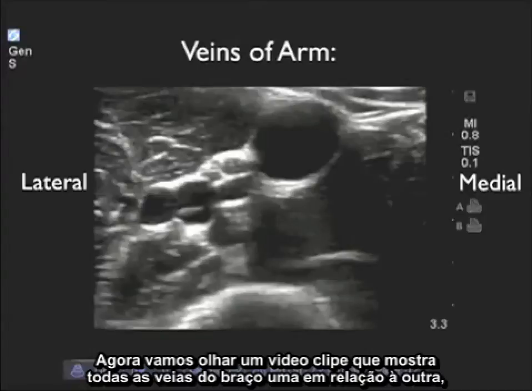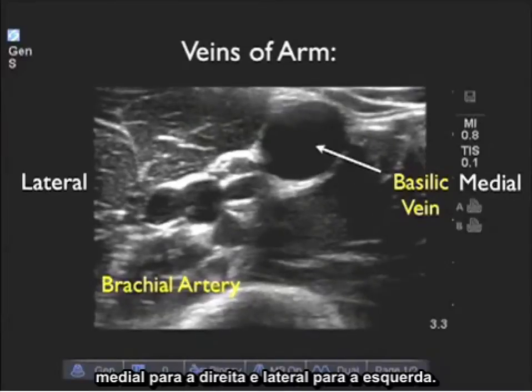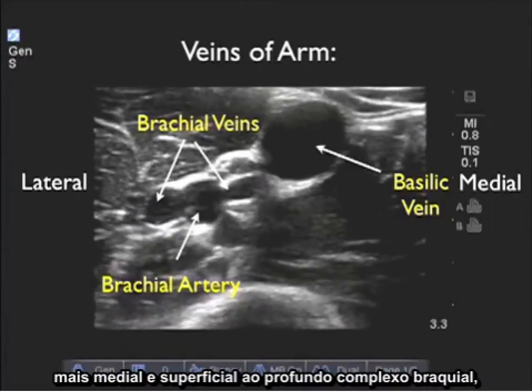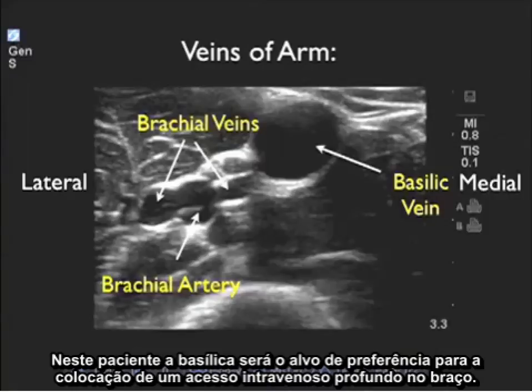Now let's look at a video clip showing all of the veins of the upper arm in relation to one another. Medial is to the right and lateral is to the left. We see the larger and more superficial basilic vein medial to the brachial complex, which includes the central brachial artery and two flanking deep brachial veins. In this patient, the basilic vein would be the preferred target for placement of a deep arm IV.